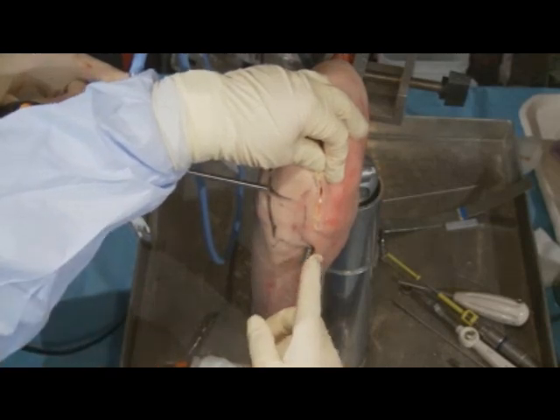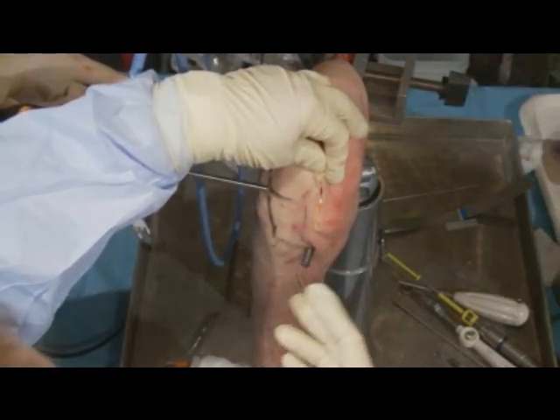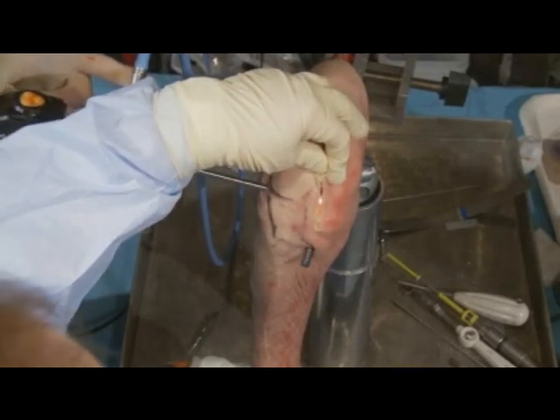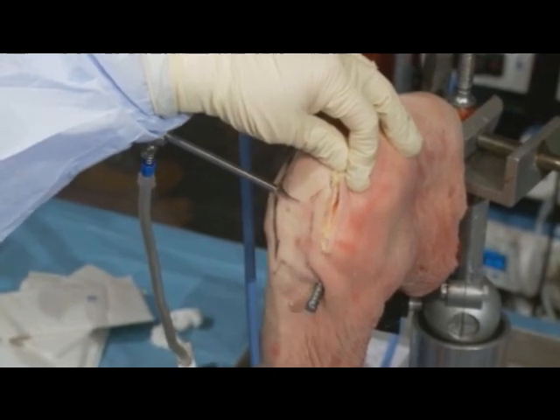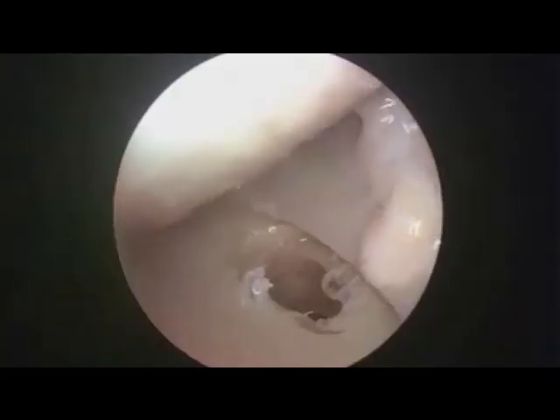Now, as you can see here, we've already inserted one of our tibial screws, which is going to stay in place and helps us in the implantation of our tibial implant. But I'm just going to go to the arthroscopic portion. We'll go through the steps as to how we insert this screw. So can we go to the arthroscopic portion of the procedure, please?